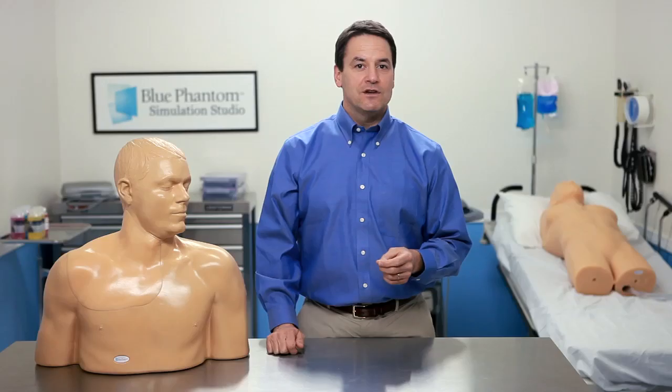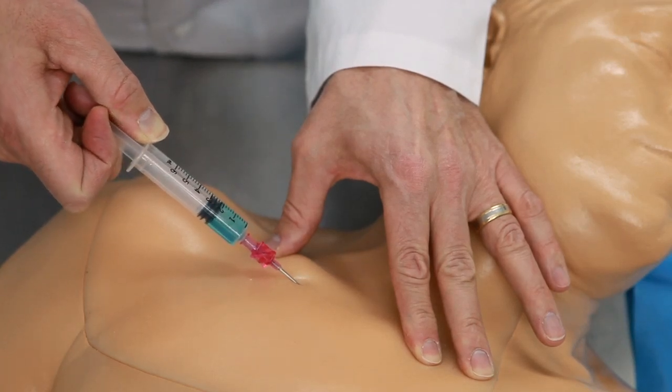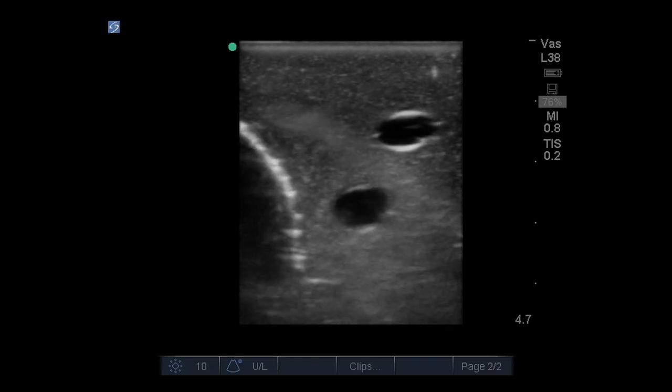Or, as an option, you can add nerves so you can practice regional anesthesia procedures. Whether you're targeting the IJ, subclavian, and axillary vessels, or the brachial plexus, we give you the anatomy you need.